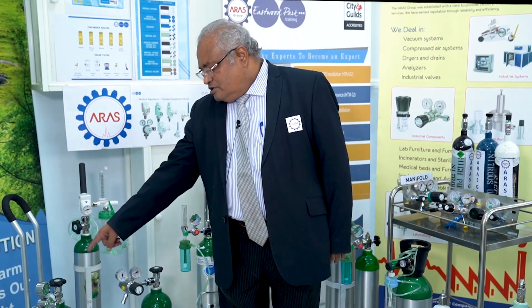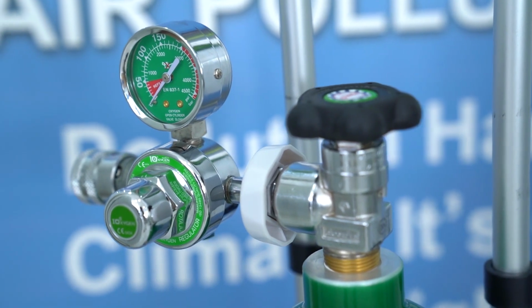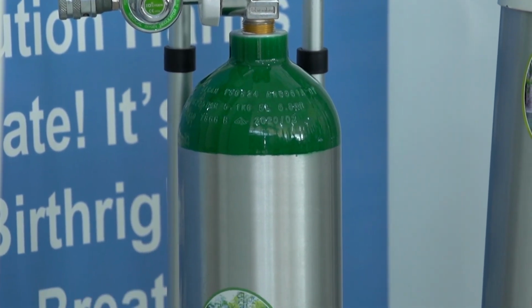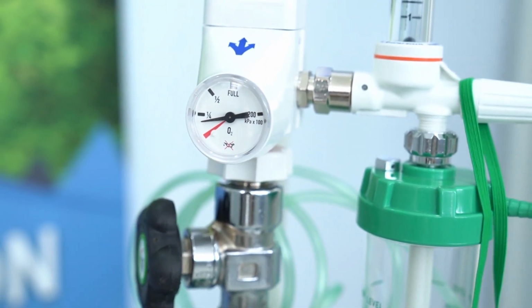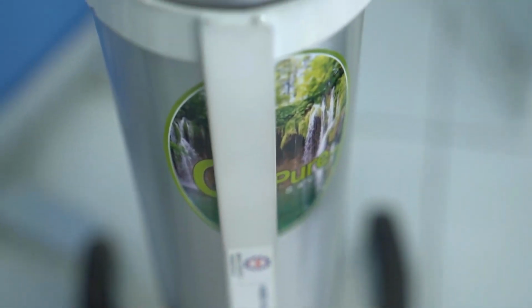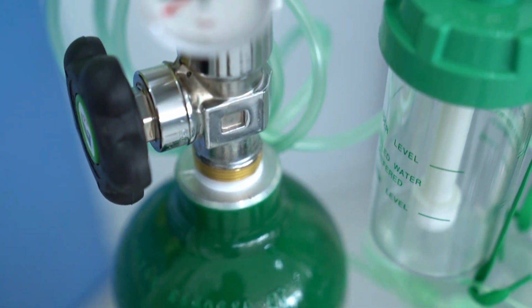One is oxygen, which we are actually using. We are talking about the bullnose with the Schrader valve, which you can use for the machine as well as for the patient. The second one is a single stage regulator. This regulator you can use for flow meters, and also for the nebulizer and face mask. That is the second one.